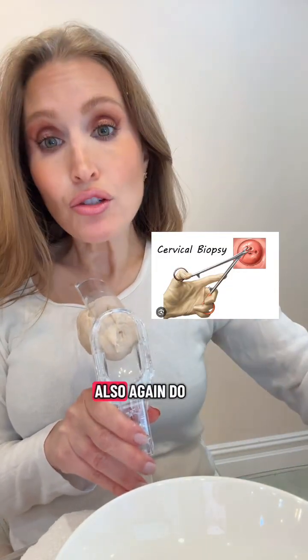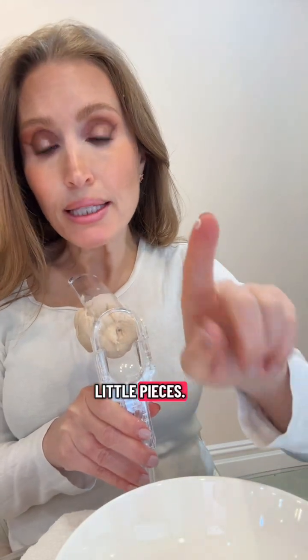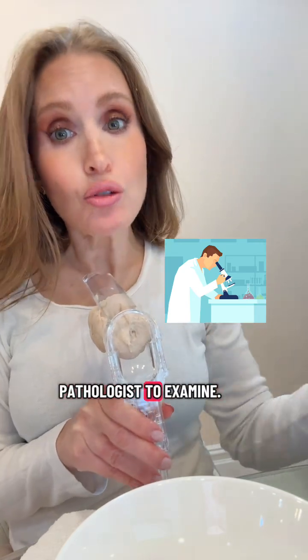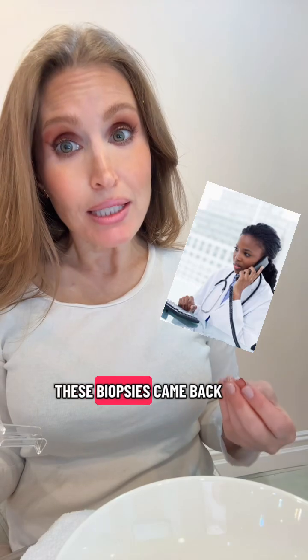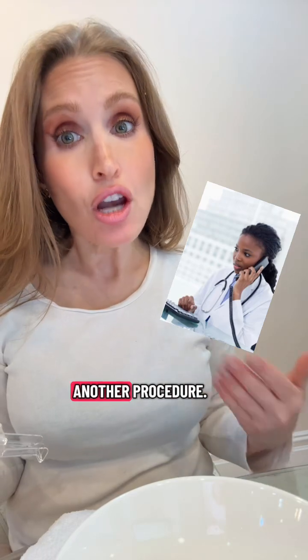Your doctor will also again do a scraping inside the canal, but no large chunks are taken, just small little pieces. This is sent, like the Pap smear, off to the pathologist to examine. You hope everything's okay, but unfortunately your doctor calls you back and says, we have a problem. The results of these biopsies came back for high-grade dysplasia or cervical cancer, and now we need to perform another procedure.